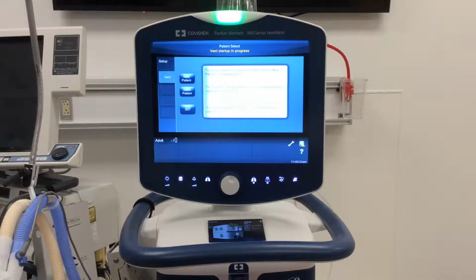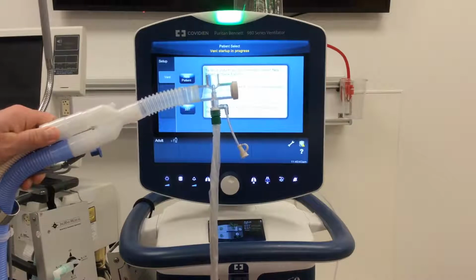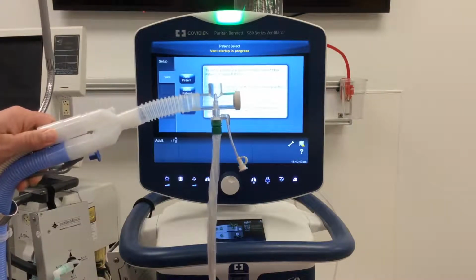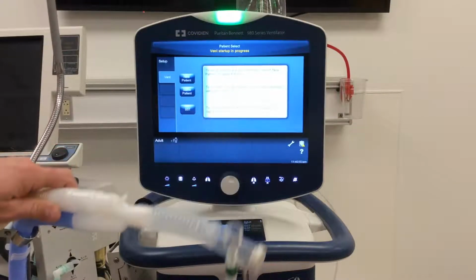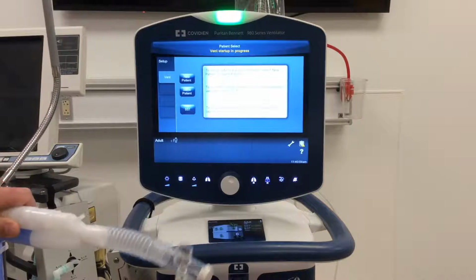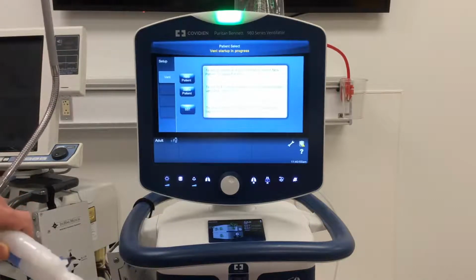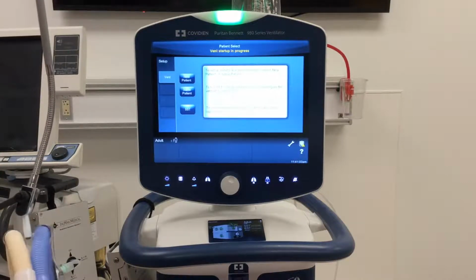All right, so I have my circuit on, everything we talked about before we went out on spring break, or this extended spring break. I turned the ventilator on. The thing to remember about the 980 is ensuring, and this is the same for the 840, that when you turn the ventilator on, you do not have any occlusions on the end of the circuit. If you do, it freaks out, thinks you're hooking the patient up without ventilation. It's going to alarm incessantly, one of those high priority alarms that's red at the top. And you're essentially going to have to start over from scratch, okay? So try and keep that in mind.